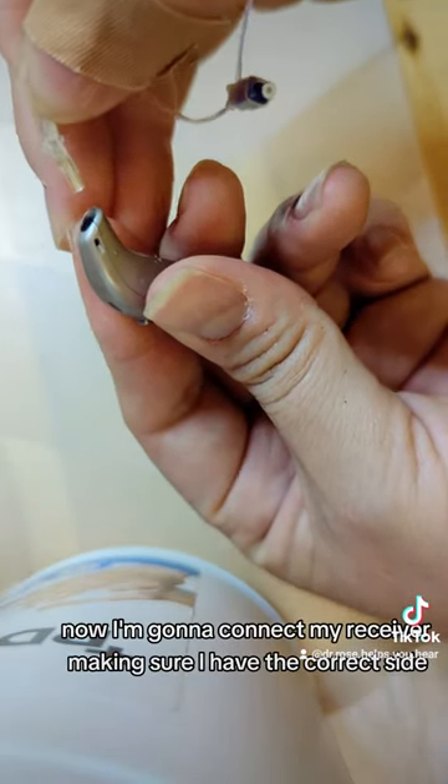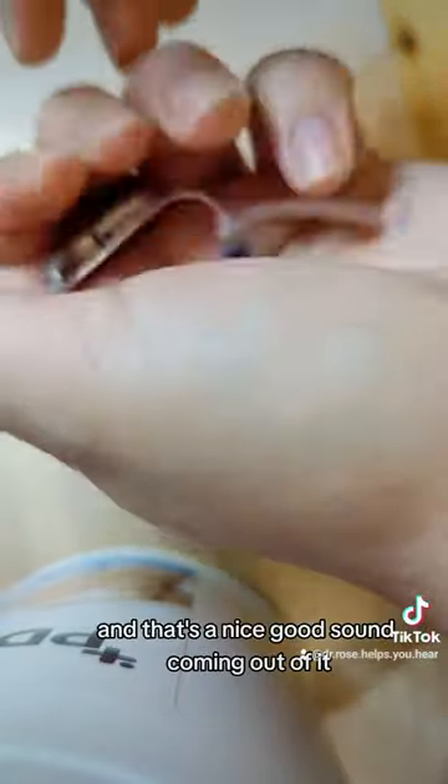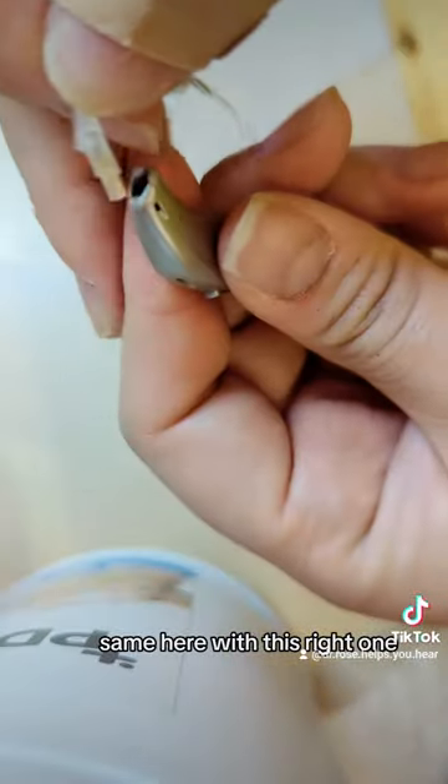Now I'm going to connect my receiver, making sure I have the correct side. And that's a nice, good sound coming out of it. Same here with this right one.